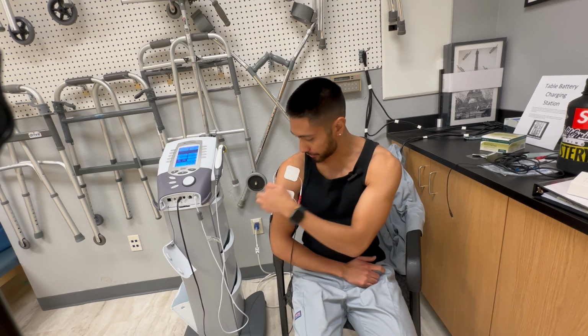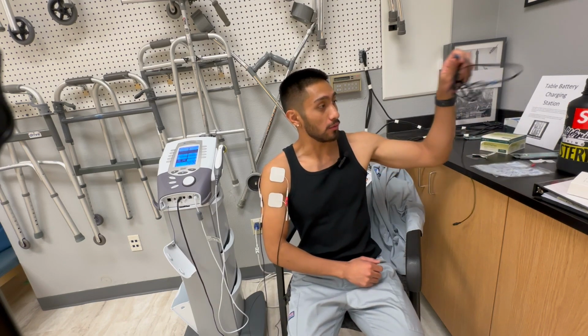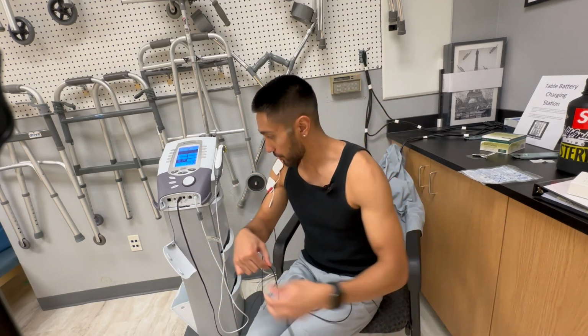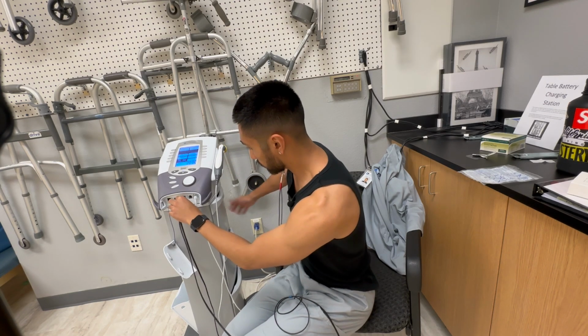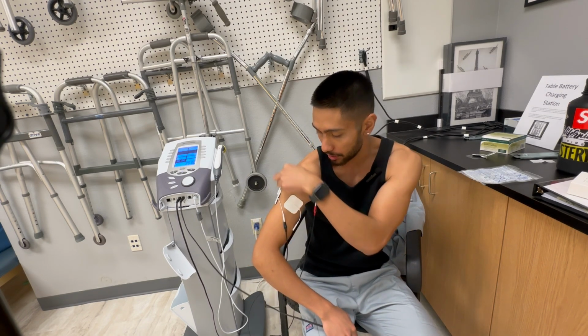Channel 1, nice and across. This first wire. Now we got the... See, bro? Second wire, going for the second channel. Plug it in there for the second channel. This one is going across this way.